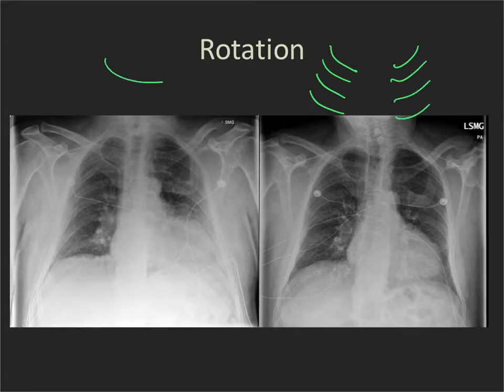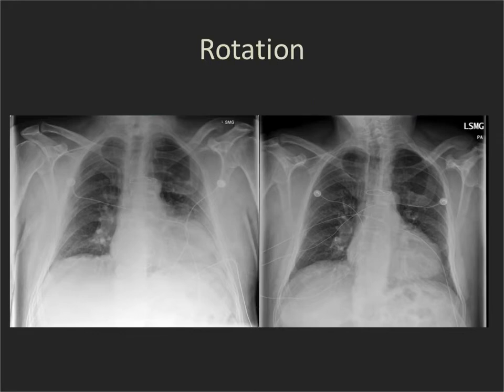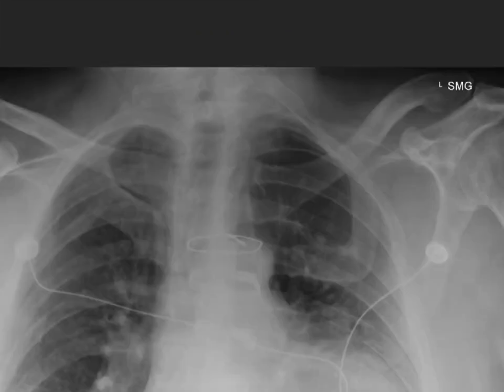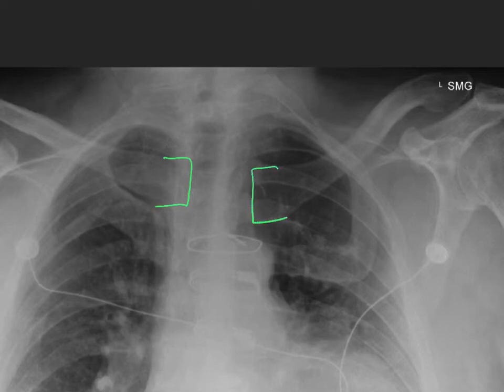A kid who's rotated is going to have one side looking long and the other side being foreshortened. So let's look at this image pair. This is a rotated image and this one is not rotated. I'm going to zoom up a little bit so we can look at the medial ends of the clavicles. Here is the medial end of the right clavicle, here is the medial end of the left clavicle, and here is the spinous process — clearly not central.